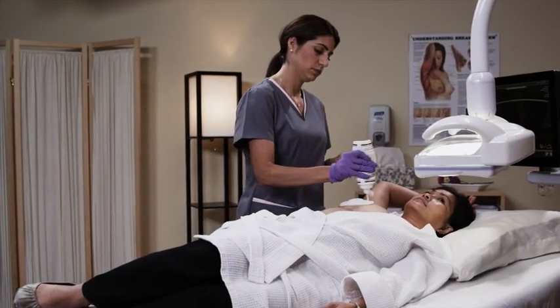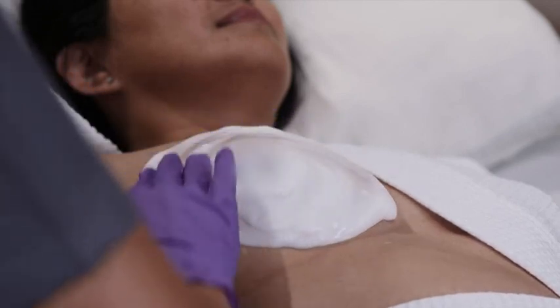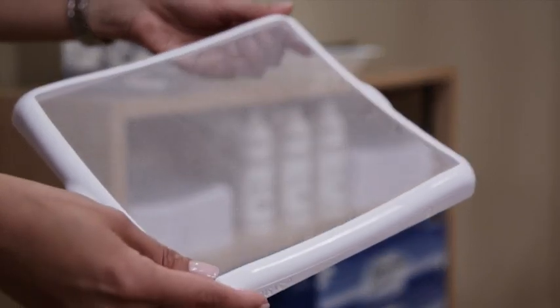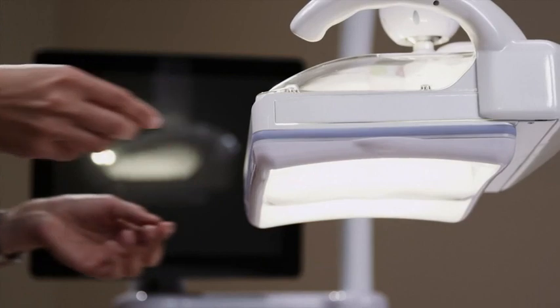Hypoallergenic non-toxic ultrasound lotion will be applied evenly on your breast to help improve the Invenia ABUS system's visualization. A disposable mesh membrane will cover the transducer and help provide light compression. A new membrane is used with each patient.